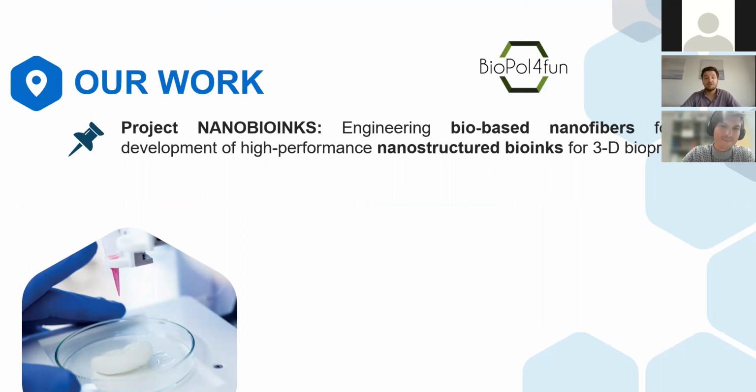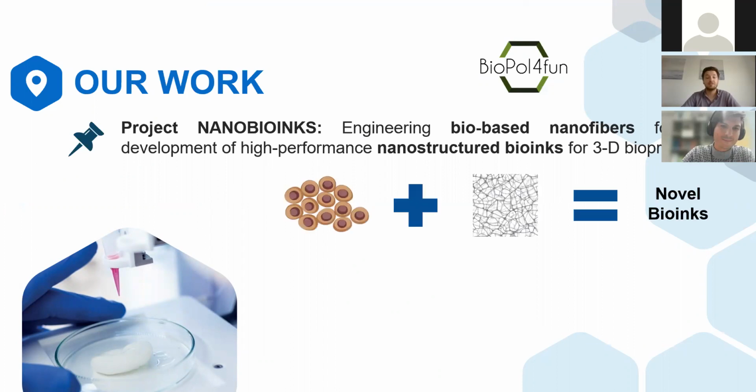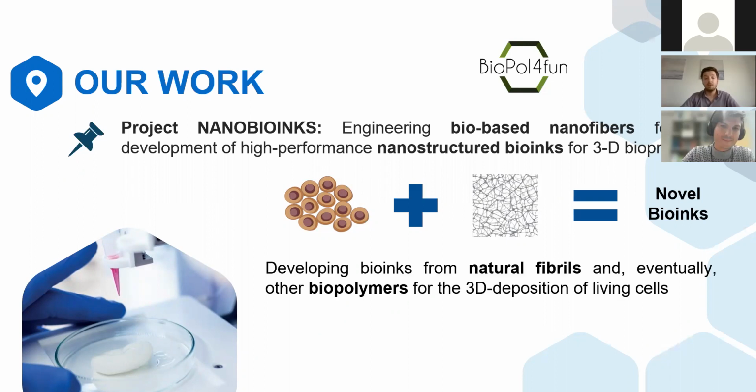It's about engineering bio-based nanofibers to develop nanostructured bioinks for 3D bioprinting, which means, very simplified, that we take our cells and we use natural fibers to create new bioinks. We are doing this, but we eventually are using or adding other biopolymers to the equation to make things more interesting.